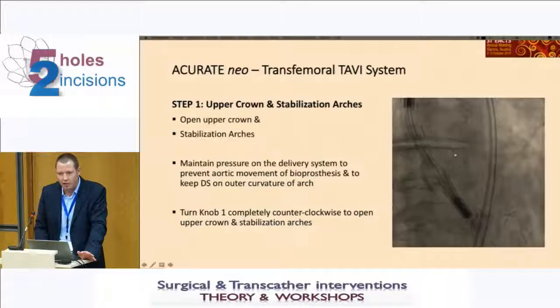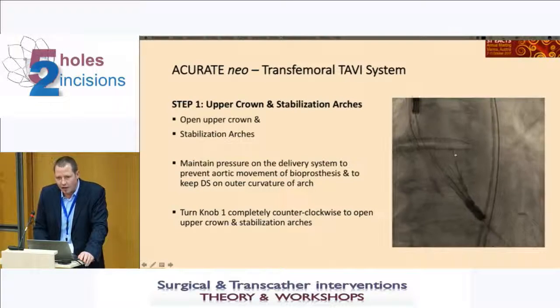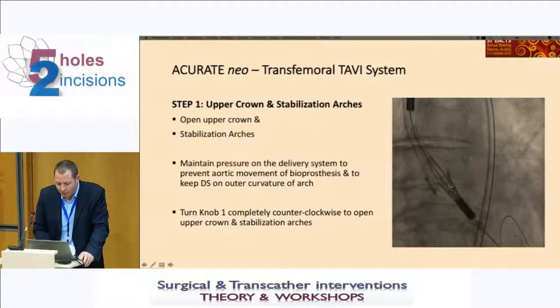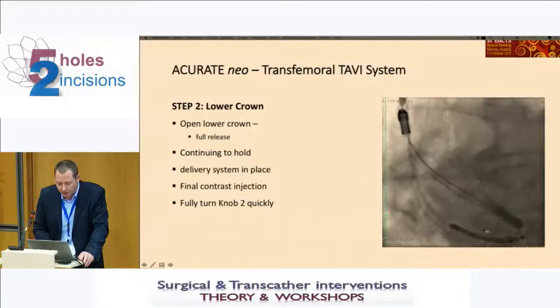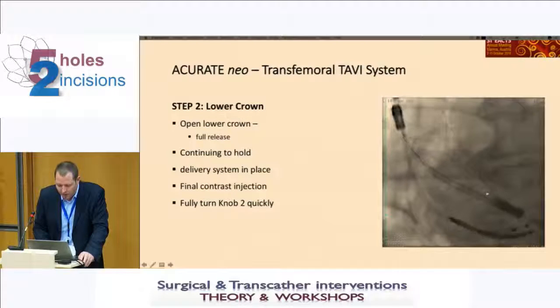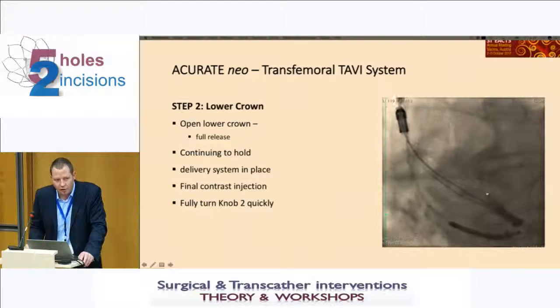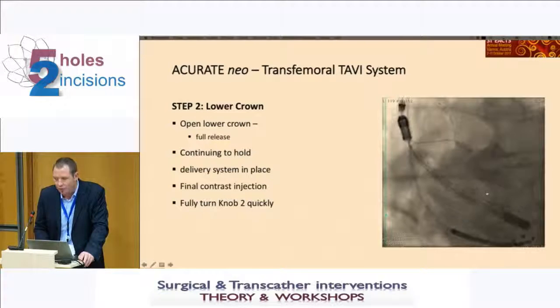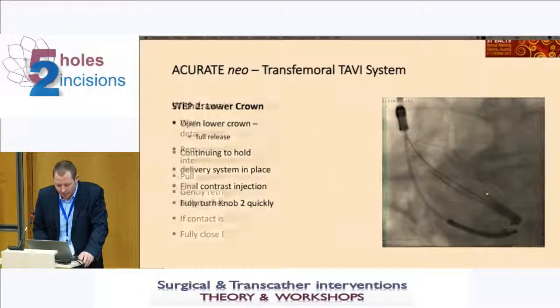So you start to understand that there are lots of pros and cons with all the different devices, and it really takes a while until you understand all these different features. So once you have it in good position, then again, a benefit of this valve is, if you have a close look during the deployment here, it's absolutely stable. Once you manage the initial positioning, the arches help you to uprighten the prosthesis, then it's going to be a super stable deployment, even without rapid pacing.